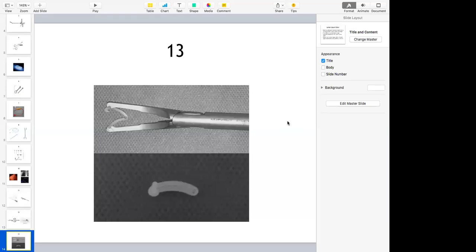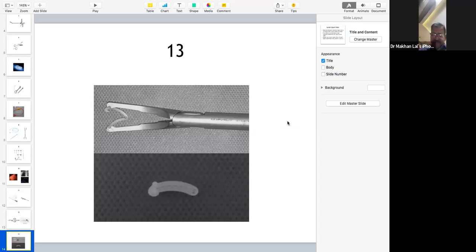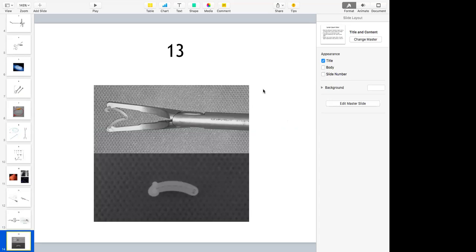Generally you have a single adrenal vein or suprarenal vein. Where does it drain? Right side, left side, same or different? This is basic. The left side drains into the left renal vein, and the right side directly into the IVC, or at the junction of IVC and renal vein, or sometimes higher up even to the hepatic vein. So the clip is used to control the vein. Arteries can be taken down with an energy device, bipolar or LigaSure or Harmonic.